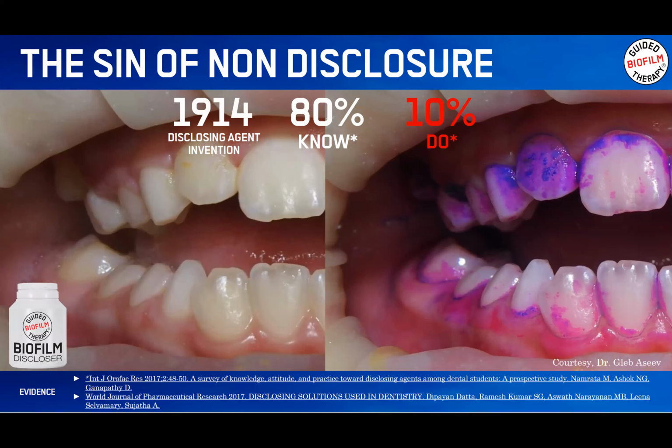On the left, we can see a little bit of the biofilm, but once you use the disclosure, you see a lot more. And if it was hard for us as dental professionals to see it in the left side picture, imagine for the patient. We are talking about biofilm and calculus, but if the patient doesn't see it, they don't believe it. Once you use the disclosure, the patient is going to say, okay, it's not a myth, I have something in my mouth that I need to remove. This is biofilm, and I know the areas that I have to work a little bit more at home.